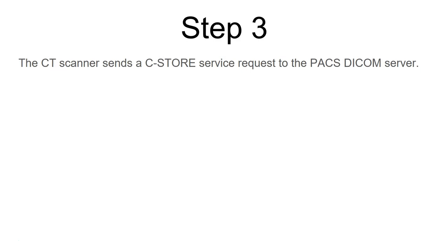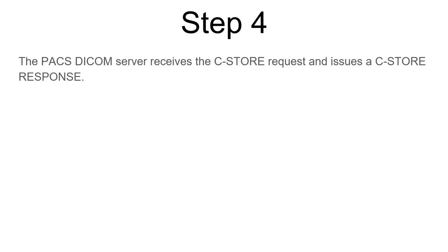then the CT scanner sends a CStore service request to the PACS DICOM server. Okay, I am ready to store the images now. I'm going to send them to you. The PACS DICOM server receives the CStore request and issues a CStore response. Okay, yes, I can now take your images in.